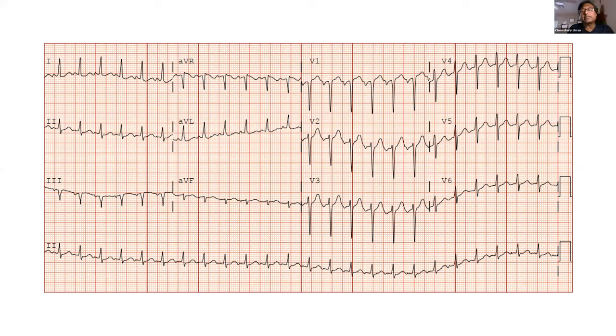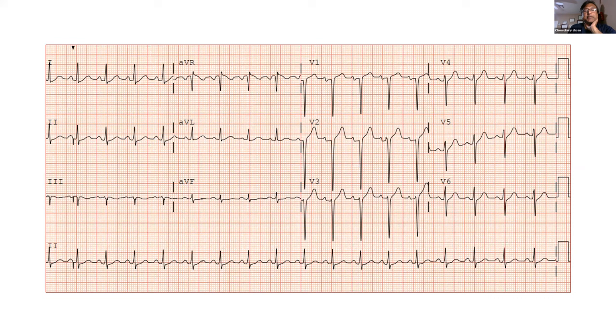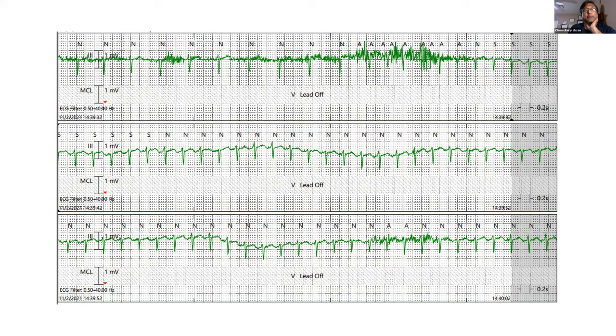So I was thinking, does it matter? But it can matter, because if it remains the same, then the therapy is also very important. So this is the rhythm strip, and they get frequent calls from the tele. So that's why I thought that this is important to show.